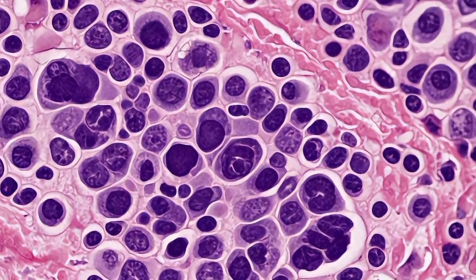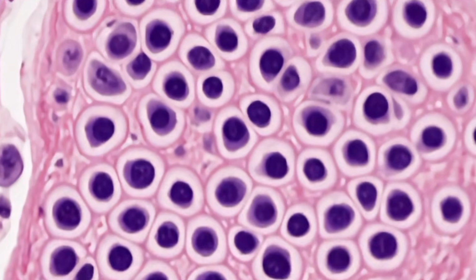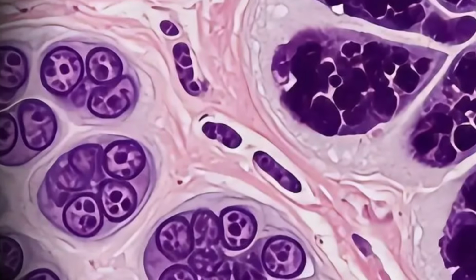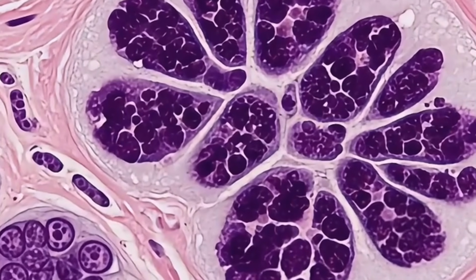Take a close look at the nuclei. Do they all look the same? They don't. Some are larger, some are darker, some have irregular shapes. Instead of the small uniform nuclei we saw in normal breast tissue, these cells have lost their normal appearance. Pathologists call this nuclear pleomorphism.